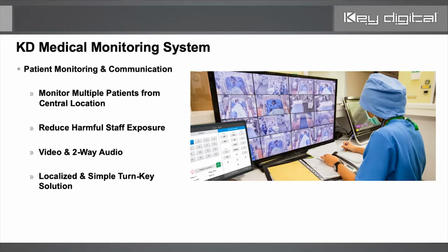Now, this system is bidirectional. Meaning, and we'll get to the patient's room, the patient has a help button there. When that button is pressed, that room lights up, and then the nurse can immediately select it. So she'll see that room 2 needs assistance. She'll select that, she could zoom in on the camera, and then she'll be able to talk to the patient back and forth live without necessarily going into an exposed room.